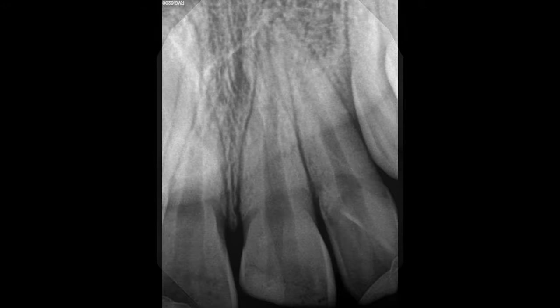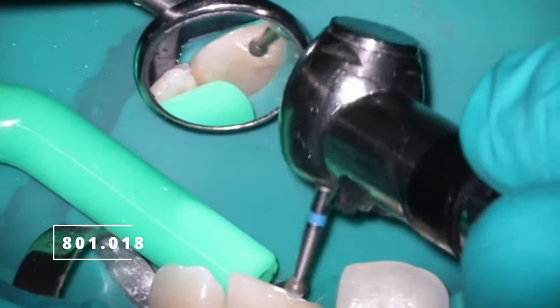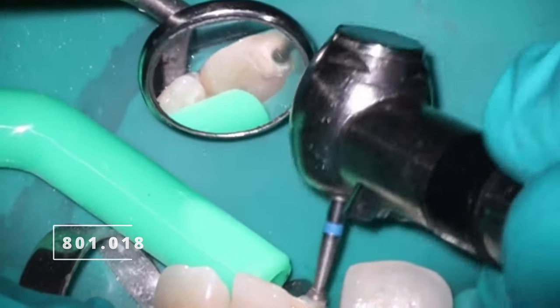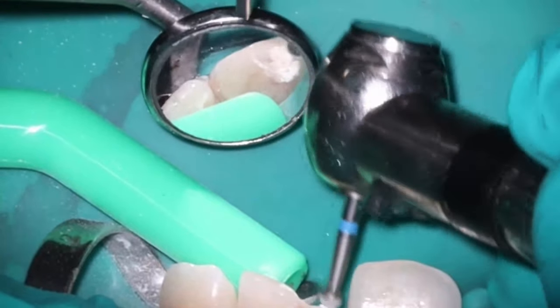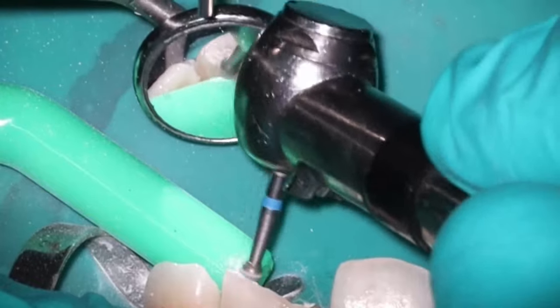The general dentist went and placed an IRM direct pulp cap with some composite on top of there, and we are going to be doing a Cvek Pulpotomy today. So first thing we need to do is remove that existing composite because I want to get the IRM out of there. While it is a great temporary material, long-term, it can cause pulp necrosis and some other issues.